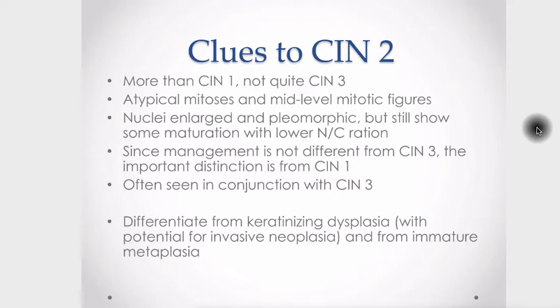However, since management of these lesions is not particularly different from CIN3, the really important distinction is to make sure that this is not CIN1. Because once we call it CIN2 or greater, that's going to take the patient down a different management scheme in terms of testing, follow-up, potential surgery, ablative procedures, and so forth.